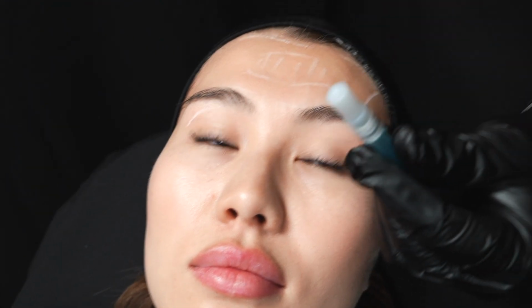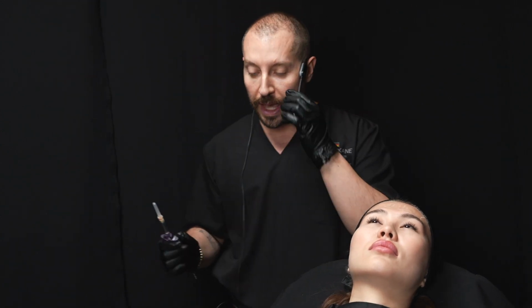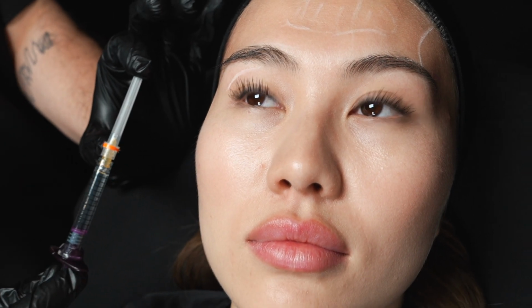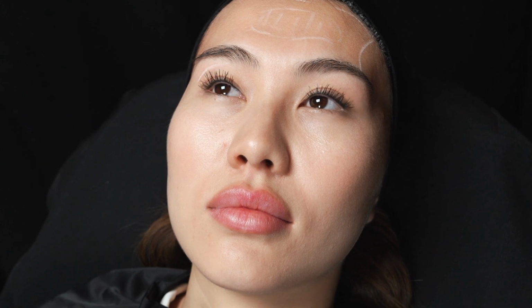То есть у нас есть две иглы, которыми мы можем работать. RHA4 приходит в коробке с иглой 27, коротенькой, 13 миллиметров длиной. Но иногда эти ткани достаточно плотные, и иногда недостаточно, чтобы достичь надкостницы, поэтому я использую длинную иглу, 25 миллиметров, 1 дюйм, для того, чтобы использовать револьверную технику и достичь непосредственно надкостницы.